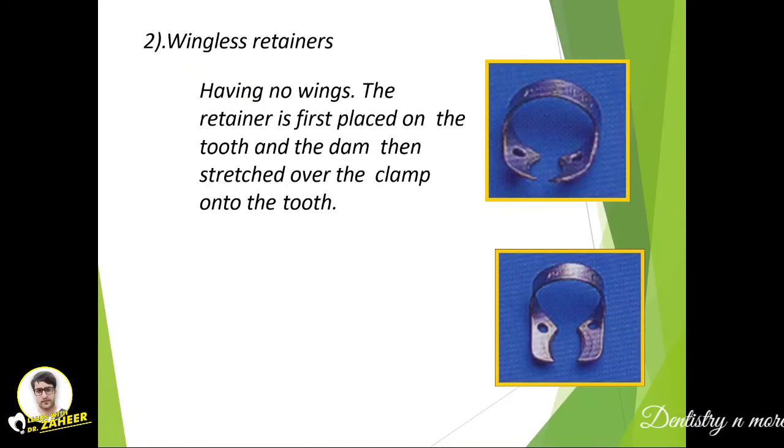The wingless retainer has no wings. With this type, the retainer is first placed on the tooth and then the dam is stretched over the clamp onto the tooth.